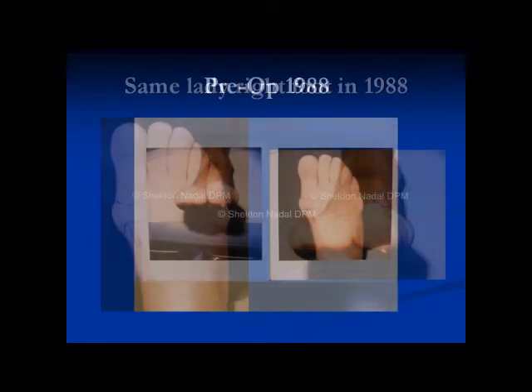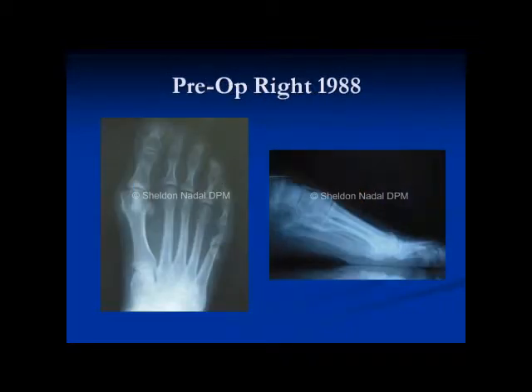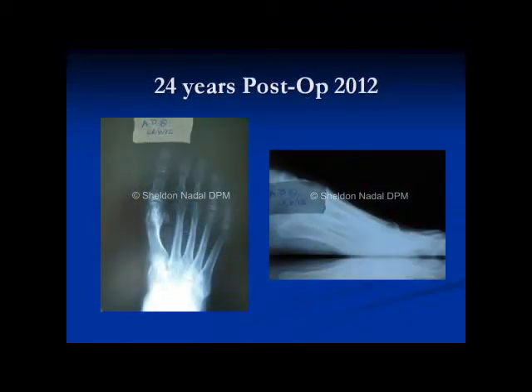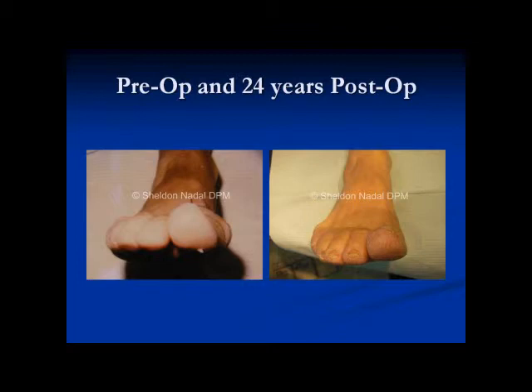Here's pre-op. And I also, I can't tell if I did a fifth met here or not. Well, let's see. I don't know if I did or not. But here's the, I didn't use K-wires back in 1988, but here's the procedure. And it did heal 1 year later. And you can see the head has healed in a very nice position. And this is what it looked like 24 years later. This is the pre-op in 1988. This is post-op in 2012. So the procedures do have longevity if you use the right procedure with the right foot.